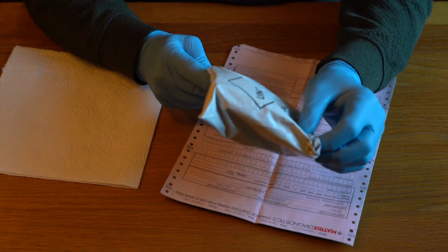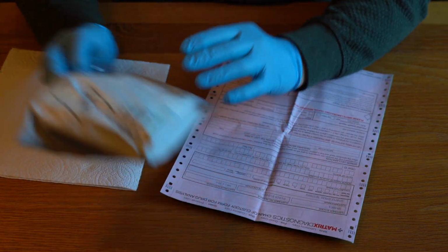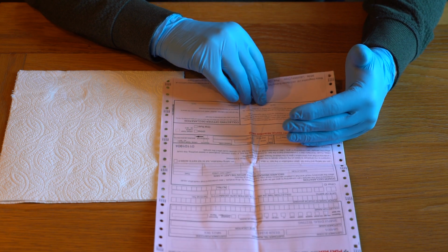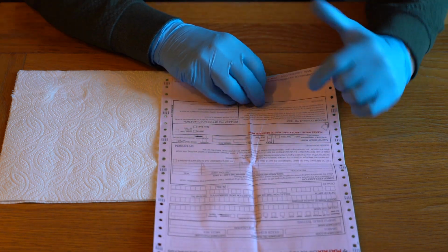So you're going to put that in a normal post box. That's a Track 24 envelope. The pink copy is the employee's copy. They have to have a record of everything that's happened as far as this test is concerned.